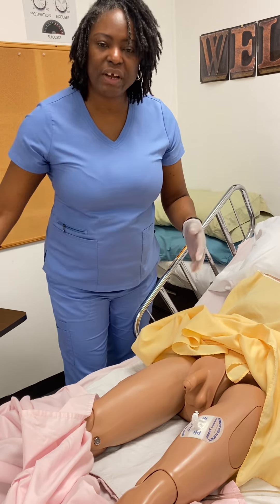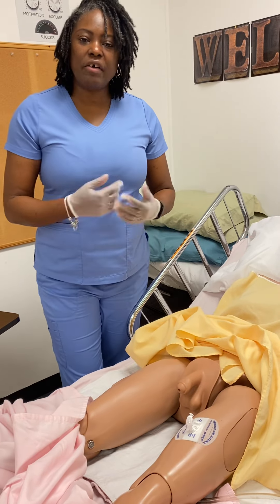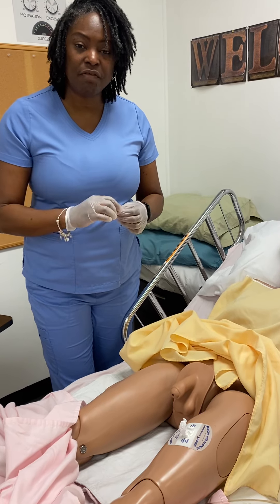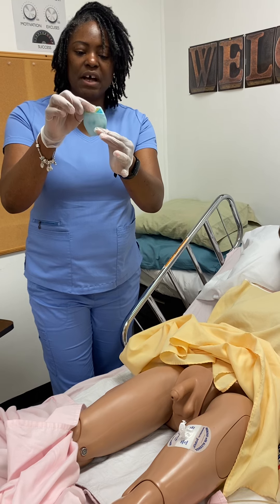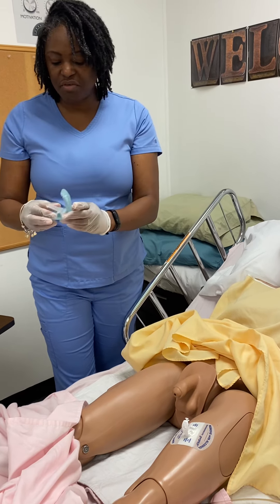We will wash, rinse, and ensure that we dry the area. So our nurse has told us to put him on a condom catheter. A condom catheter is not invasive, which means it doesn't go in the meatus. It comes in different packs, and all condom catheters have different sizes.